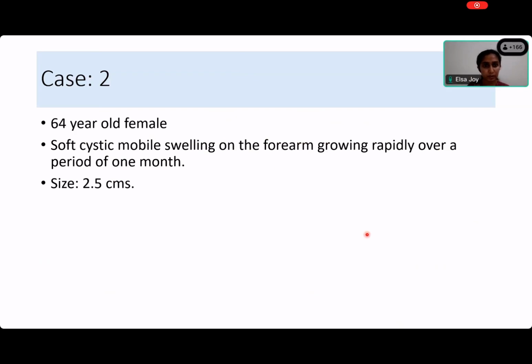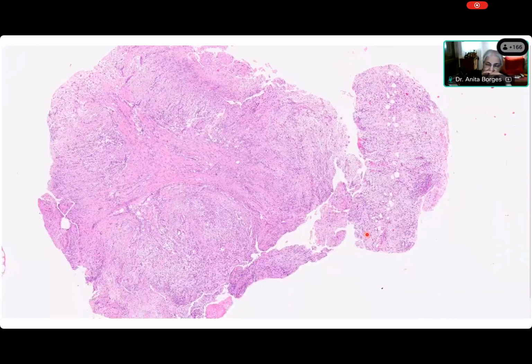It's a case of a 64-year-old female with soft cystic mobile swelling on the forearm growing rapidly over a period of 1 month with a size of 2.5 centimeters. Very good. All right, now. You've seen all this, right, Elsa? Yeah, this is the low power view. All right. Anything that you want to say at low power?